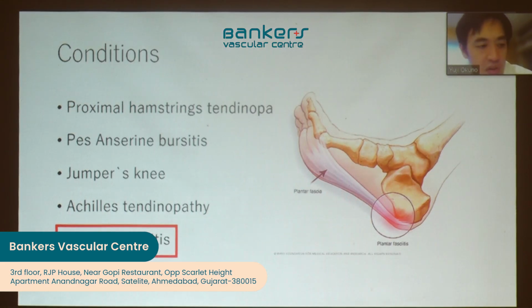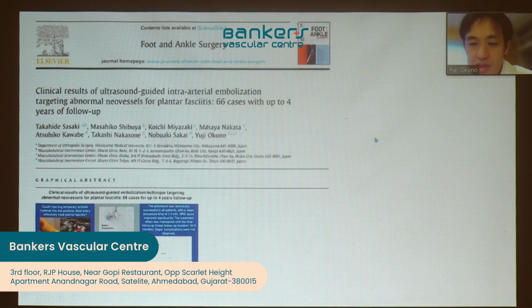And finally, I will introduce our new technique, not using a catheter, but using only ultrasound imaging. Plantar fasciitis is a good indication, and the target artery is the posterior tibial artery. This year, we published a paper in Foot and Ankle Surgery on our ultrasound guided simplified procedure.